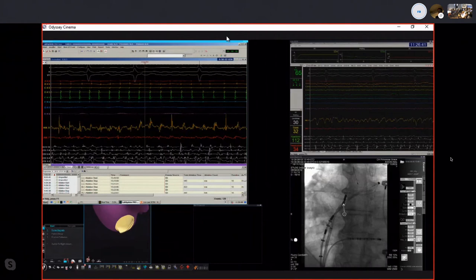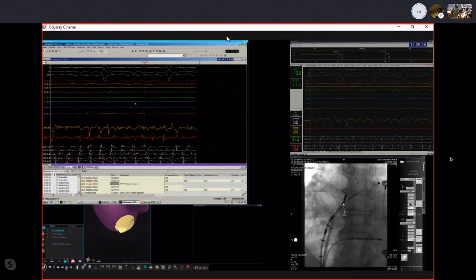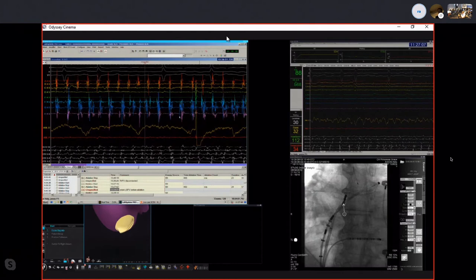Okay, this is it. So this is the comparison with the recording of the bipolar potentials, hugely amplified because you can see the baseline noise on all these equatorial bipoles. And the second reconnected vein was the left superior PV, and these are the potentials inside the left superior PV just before ablation. Let me show you how this looked on the map.